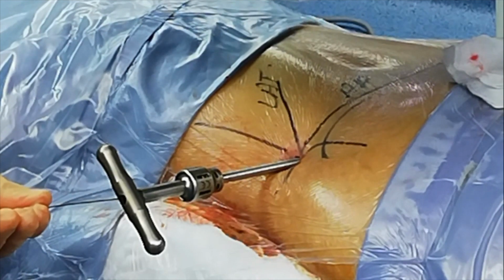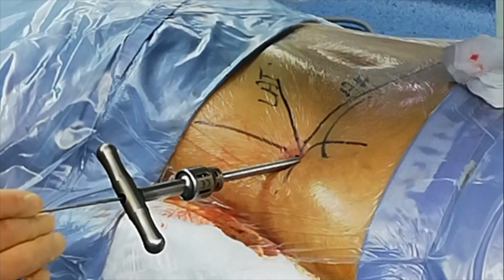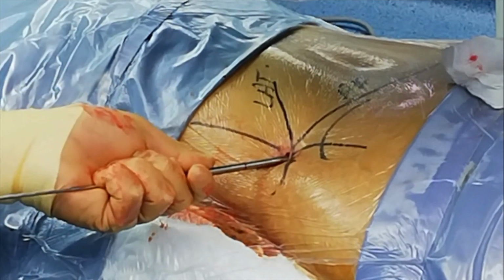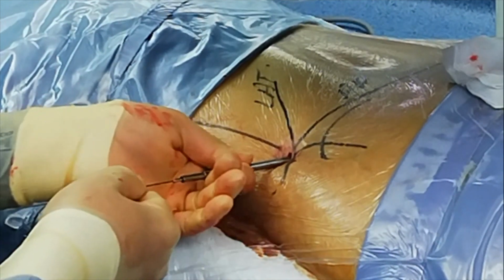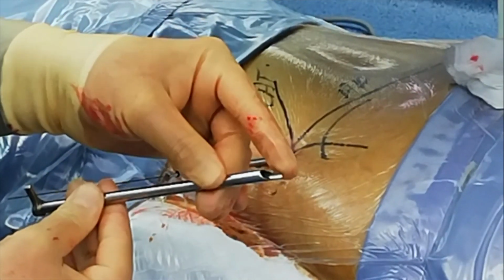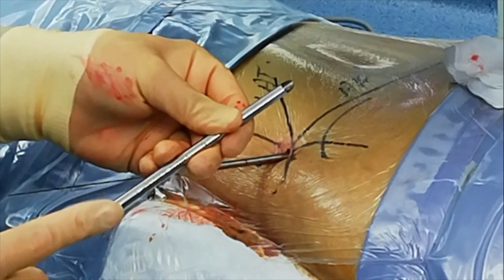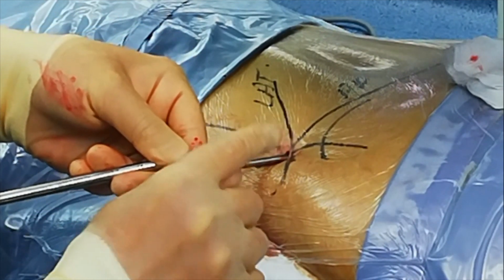Again, the stopping guide is used to keep the first rod. Now comes the cannula. So this is the working cannula. I use the longer one. A couple of these on the Joymax system, but I like this one. And remember, the knob here, the handle, is directed towards the opening of the bevel.